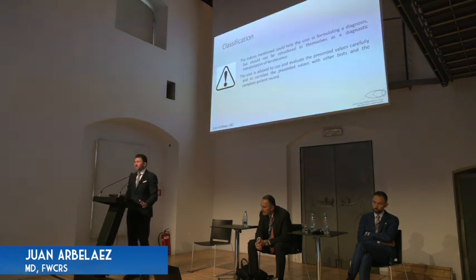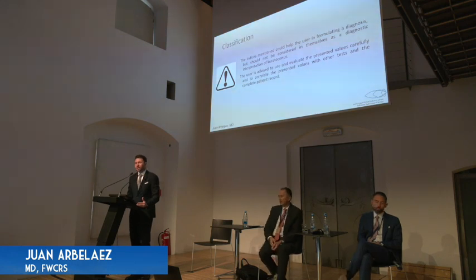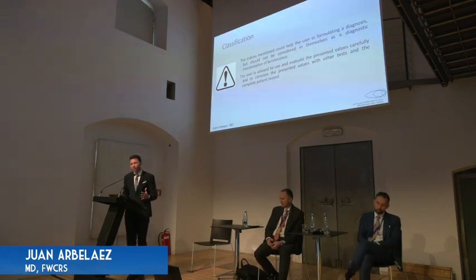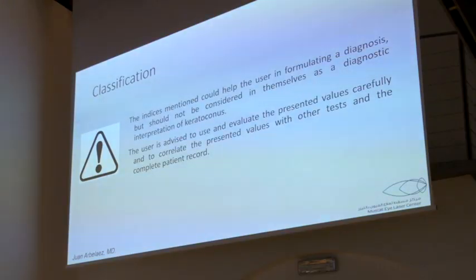So this is important to know, that the diagnosis that is going to be given by the device is just a guide for us. We need to involve the clinical part. As Ricardo was saying, we have to decide if this is a real case. We have to evaluate more things in the patients. Perhaps we are in front of a scar, we are in front of something different. So it's not a main diagnosis that we have to rely on.